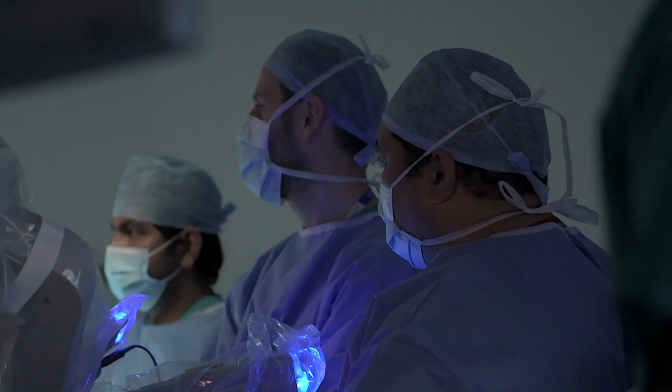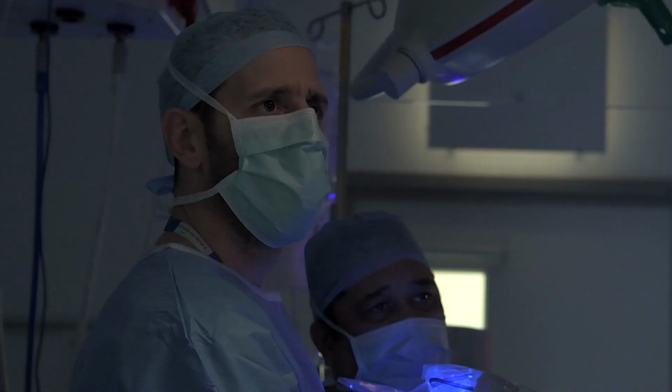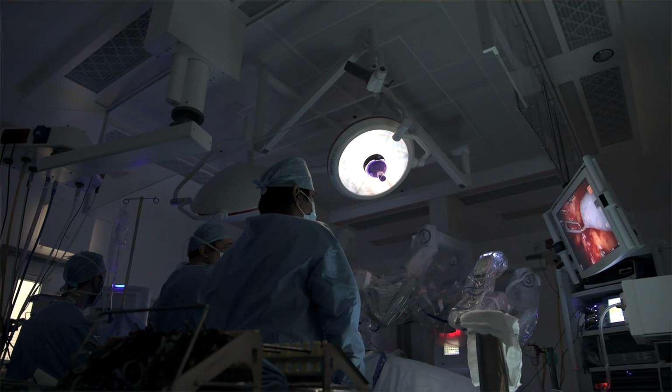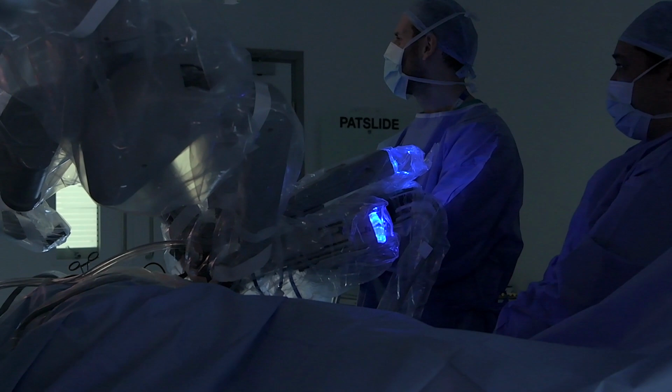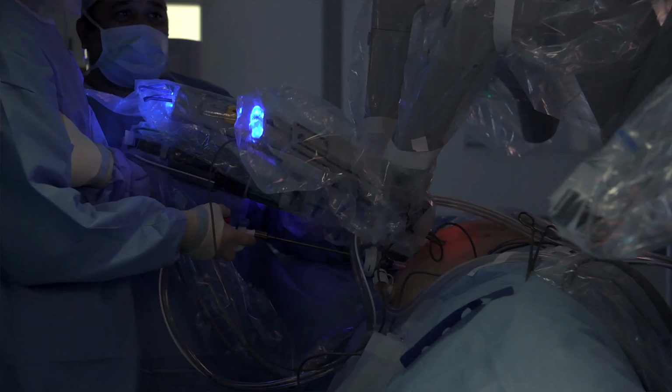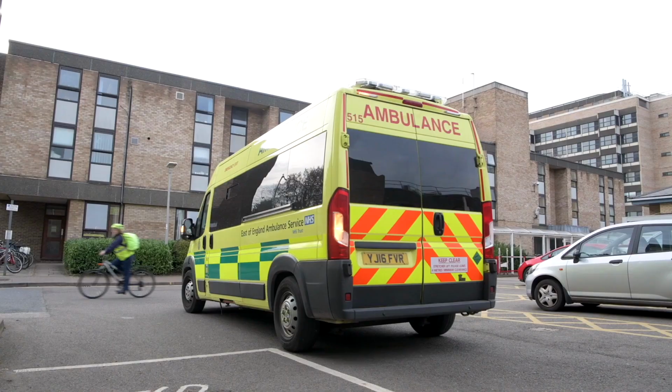In normal surgery, it is usual for us to open up the patient to get to the area that needs operating on. This means patients take a long time to recover. Robotic surgery changes all that. A surgical robot means we can make smaller incisions and be more precise. Importantly, it allows patients to recover within days so they can get home more quickly.